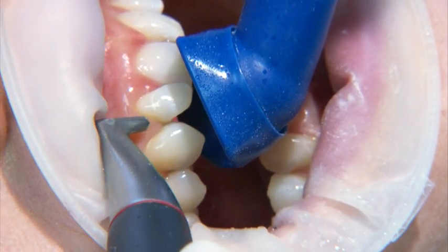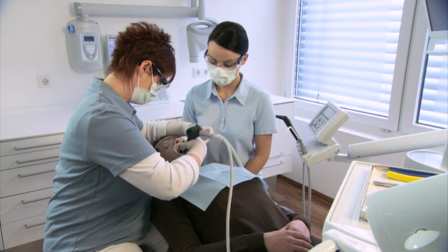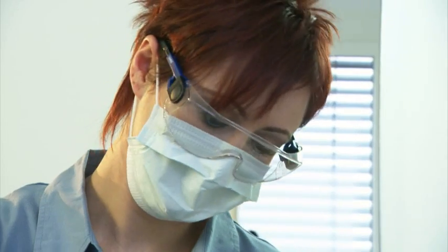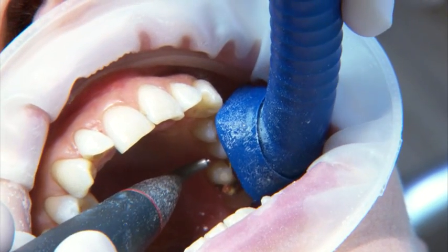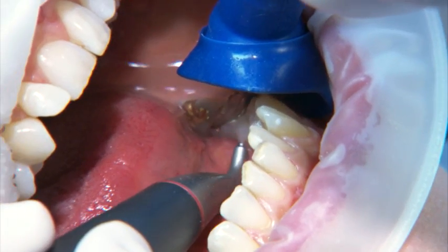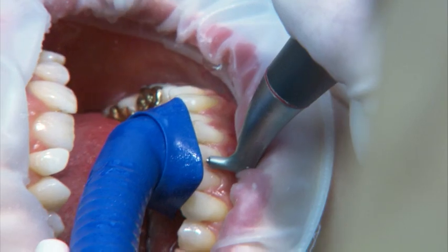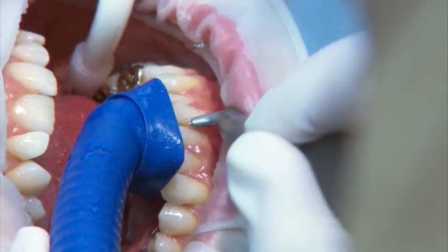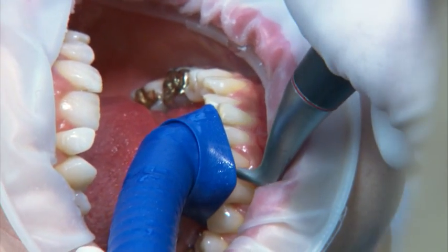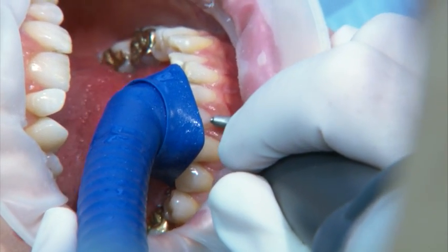The uniquely adjustable Prophylaxis cannula optimizes aerosol evacuation with spray powder in buccal and palatal applications. Effective suction significantly reduces the dispersion of aerosol with spray powder in the treatment room. Surface disinfection and cleaning are made easier, oral mucosa is optimally protected by the shield, and irritations of the oral mucosa from the spray powder are significantly reduced.